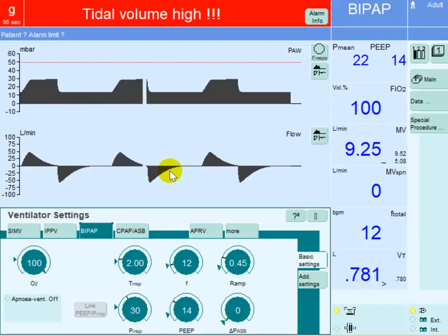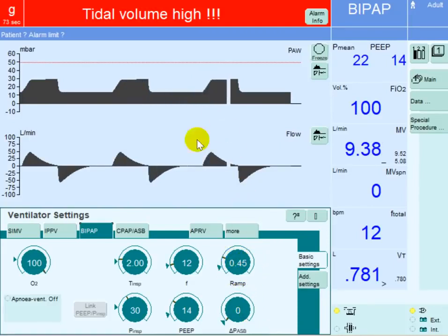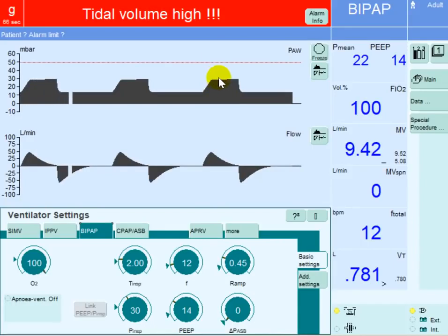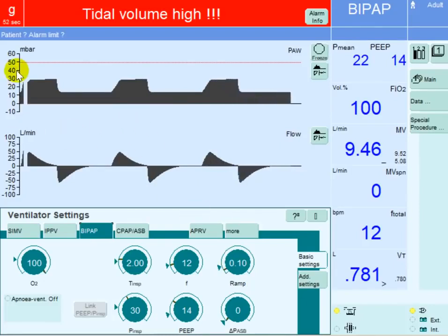The fourth parameter that can be modified to improve oxygenation and mean airway pressure would be the ramp or rise time. Looking at the rise time from PEEP to peak inspiratory pressure, it is taking 0.45 seconds. We can add more black area by decreasing this rise time from 0.45 seconds to 0.1 seconds, adding more to the initial rise of the pressure. It is a minimal amount, but in severe cases everything counts.